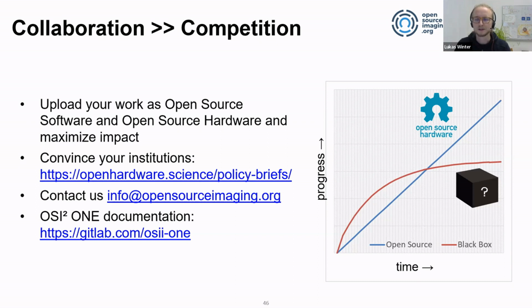But of course, it has to be also tested outside of just the research paper, and also in real clinical settings, because there's a lot of different devices, a lot of different noise sources, but also things like temperature changes that could affect your portable system, etc. So still many things to do, but yeah, it goes a little bit into answering your question.